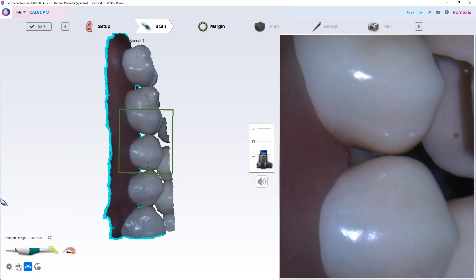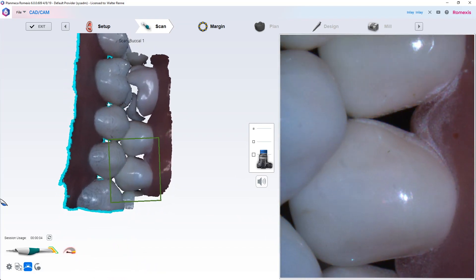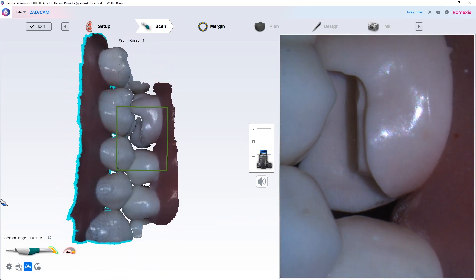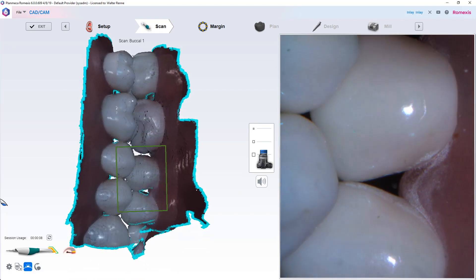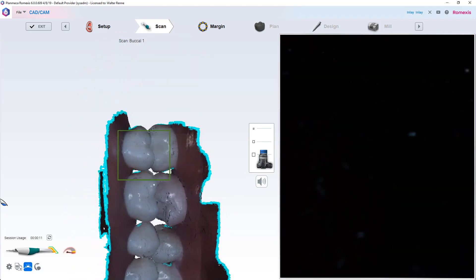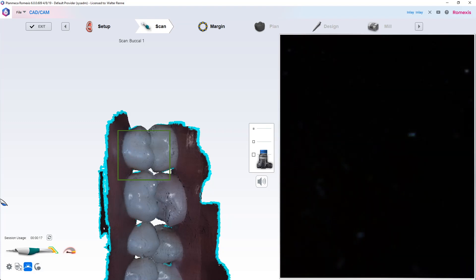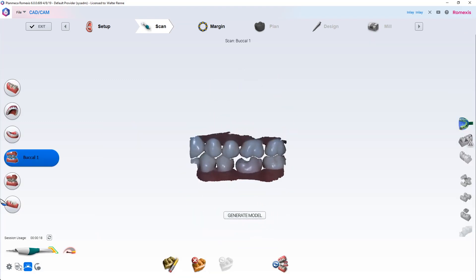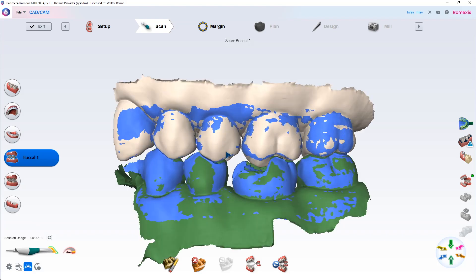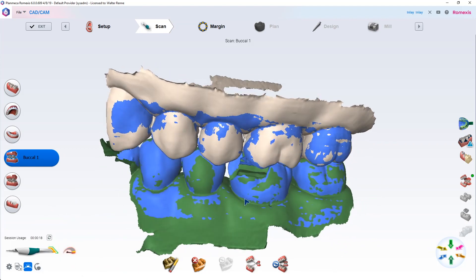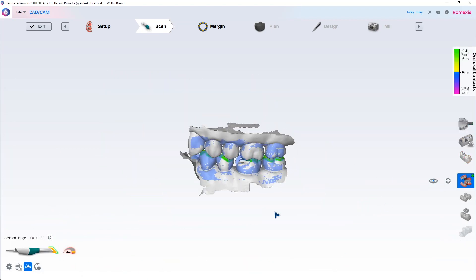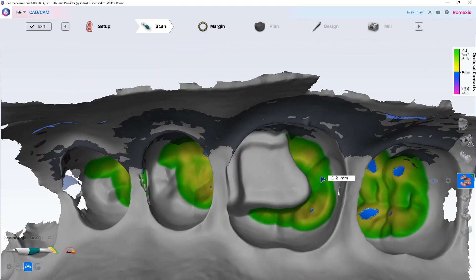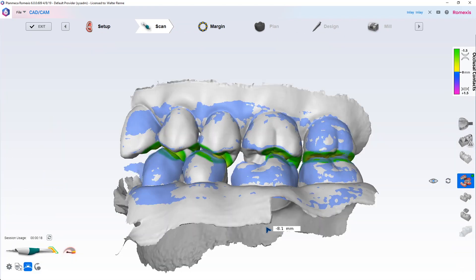The opposing scans, you definitely don't want to spend a lot of time on your opposing scans. Leaving a little bit of lingual data, focusing on one arch at a time until it goes in, and going to the opposite arch. Okay, and that's ghosting. I always like to go a little bit—I don't stop immediately after ghosting. I keep going because it actually will keep finalizing that bite and adjusting it if you give it more information. So it's kind of cool. Alright, once again, the little green icon is highlighted on the right middle of the screen, that tiny little green dot, and we have a good articulation of our bite.